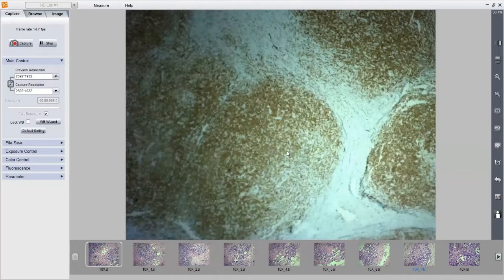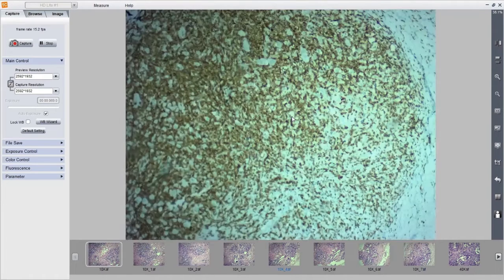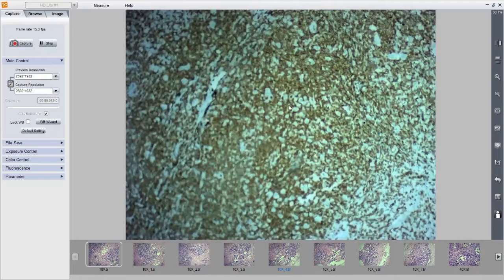Now, when I come to NLPHL, you'll understand the difference of NLPHL from that of a classic Hodgkin lymphoma. Here, we hardly saw a little bit of B cells, but the background is predominantly T. So in classic Hodgkin lymphoma, the background is T cell rich. And we'll see again the large cells here. The large cells are actually negative. This is the surrounding T cells which have taken up the CD3. We are seeing the scattered large cells within the background of CD3.